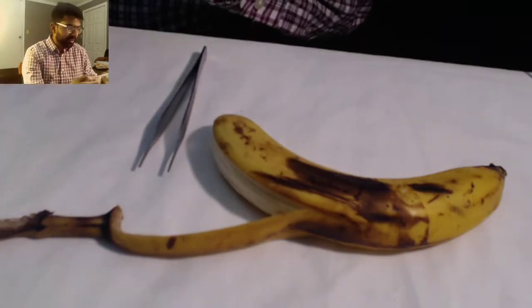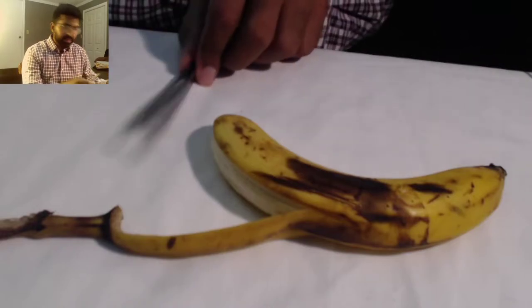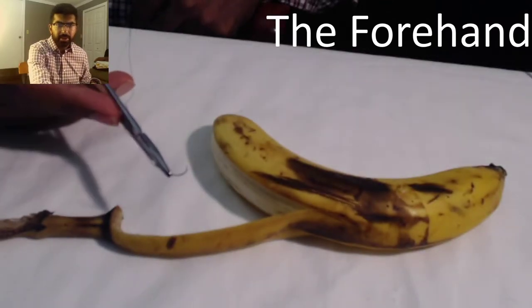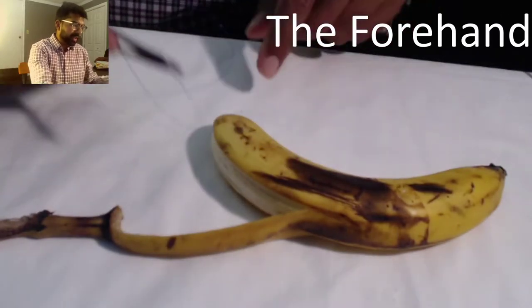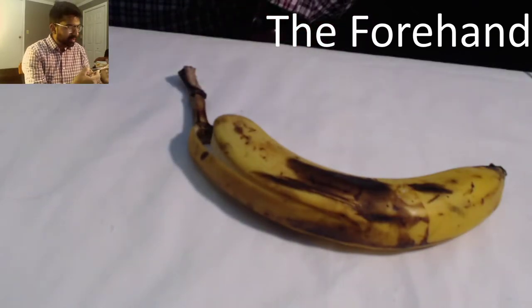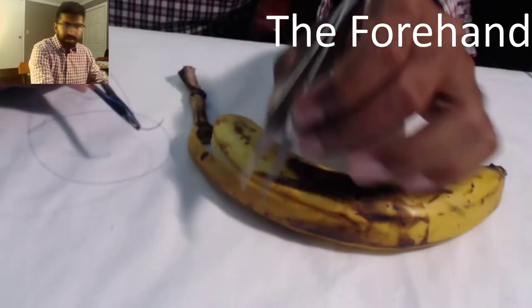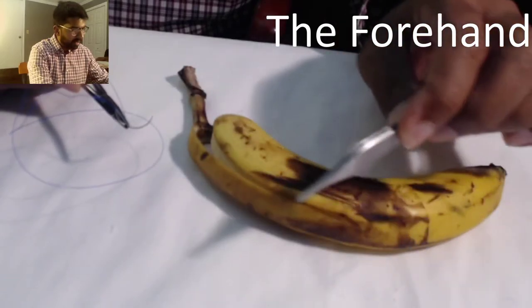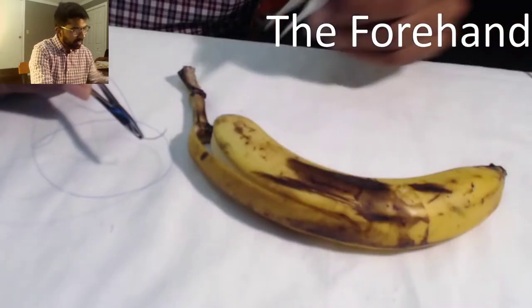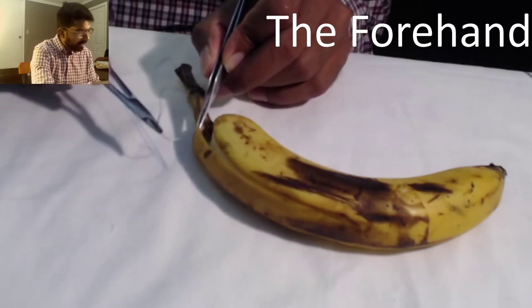So let's get to it. We're going to be throwing forehands, and then I'll show you a backhand. For the forehand, I'm going to do it with my fingers in the hole for a little bit more control, and I'm just going to re-approximate where this banana peel should be. I'm loading the needle a little bit away from me. Using my left hand, I'm holding it appropriately — not like a claw hand or grasping tongs — letting it rest between my thumb and index finger.